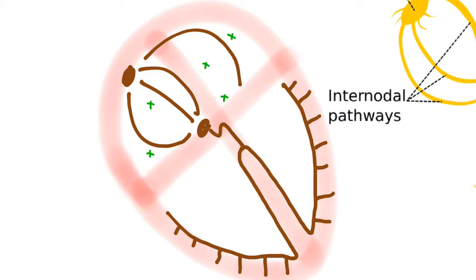Well, one thing that you're going to lose is the waveform that corresponds to the travel down these bundles here, because this one is a short trip, this one's a little bit longer, this one's a little bit longer, but you could see that it's not going to have that nice P wave that we had before. So we're going to lose that. Once you get over here, however, you're going to pause, right?